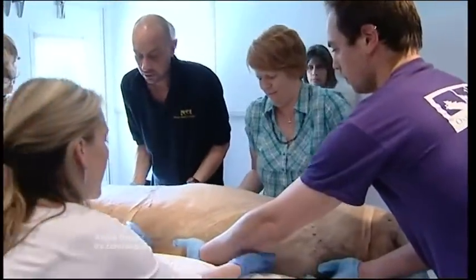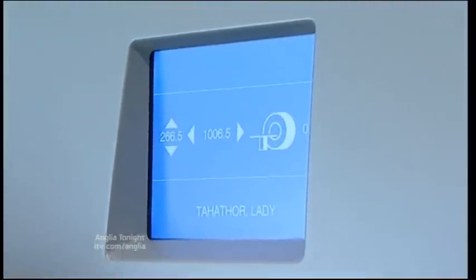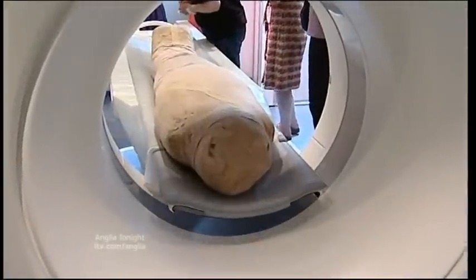But to tell us a bit more is Matt Evans, the senior radiographer. Tell us, Matt, what did you find? We've had an incredible amount of detail so far. The image count is approximately 10,000 at the moment. Key points that we've picked up in the head, you can see the contents of the brain have been removed. There's some linen packing at the back, and there's what appears to be almost finger-like bony structure in the back of the skull. It's about 7 centimetres long, so further analysis should determine what that is.